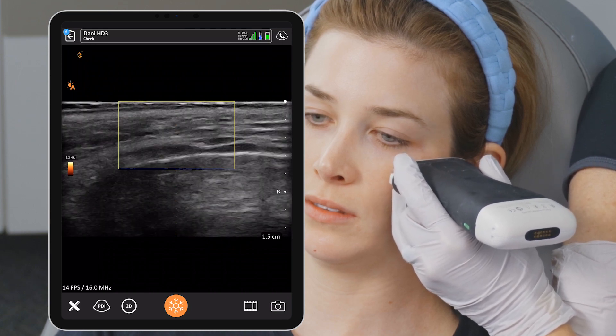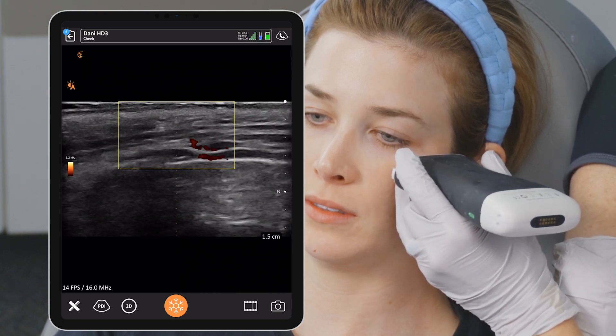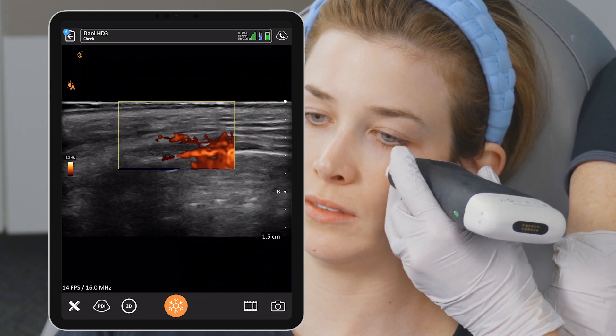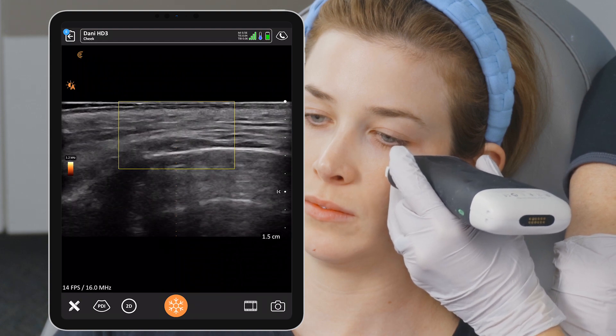Alignment. Alignment is where we double check that our midline is exactly where our dot is — where we want to put the filler. Then rotation. You want to do these tiny little rotations just to make sure you're not missing anything in that spot.